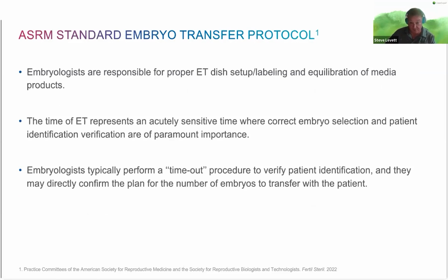Embryologists are responsible for the dish setup and maintaining optimal conditions. The time of embryo transfer, as we all know, is an acutely sensitive time where obviously the correct embryo selection and identification and all of those factors are extremely important. The patients have invested a lot of time, money, emotion into getting to this point, and we need to make sure we get it right. We do a good procedure, but also all of the other factors are in place.